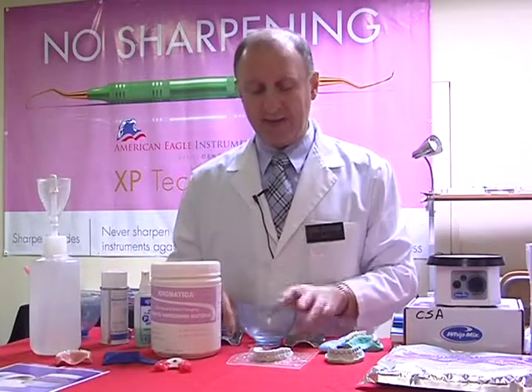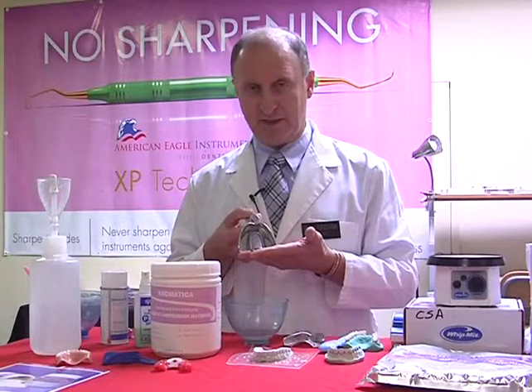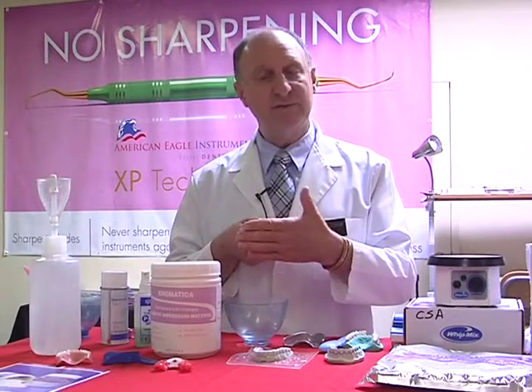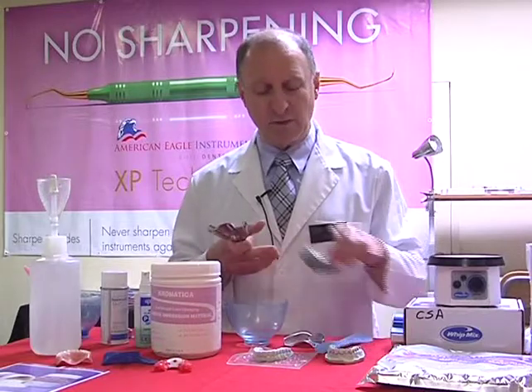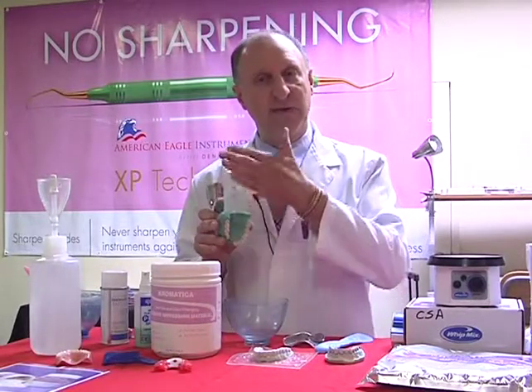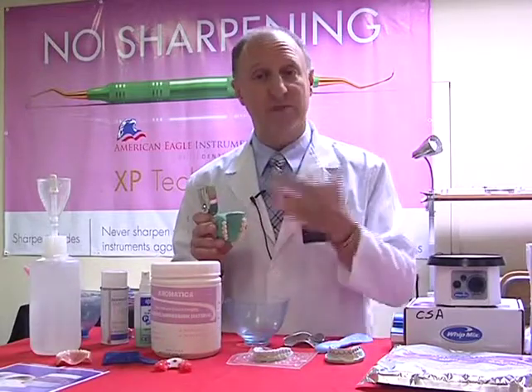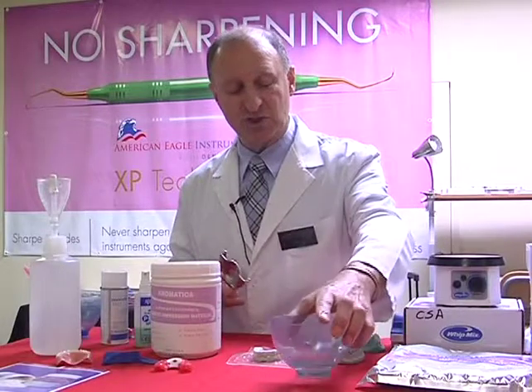I'm going to be using our impression tray, which is the solid tray. But instead of using wax at the posterior borders to dam it in, and if I didn't do that, what would happen is the distal area would be lost as the material flows out the back, and of course down the throat and onto the tonsils. We want to stop that from happening. So let me show you what I'm going to do.